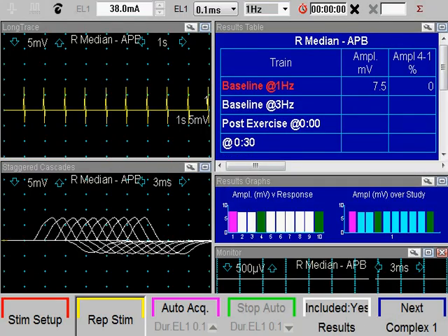Repetitive nerve stimulation is very sensitive to movements and artifacts. They affect the shape of the compound muscle action potential. Subtle changes in the CMAP waveform can be assessed better by superimposing them. Your system may have a function key or an icon for superimposing traces.